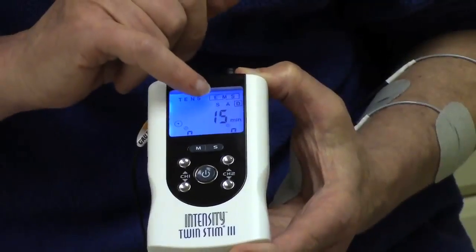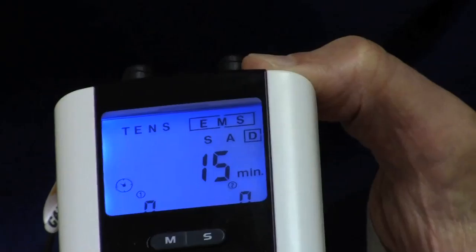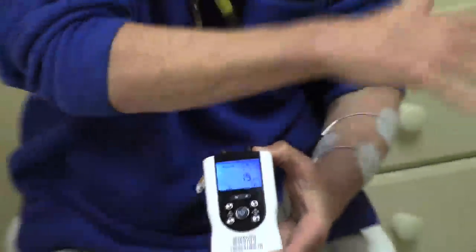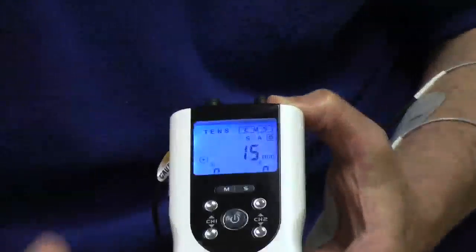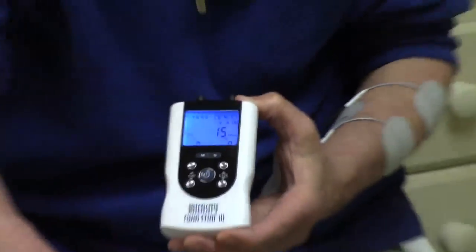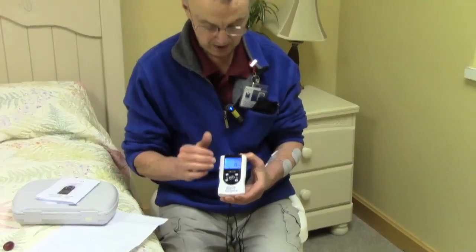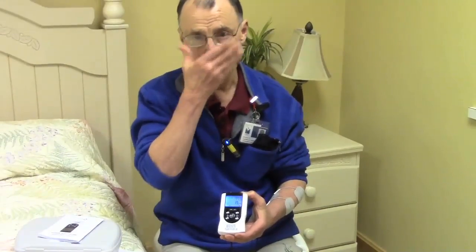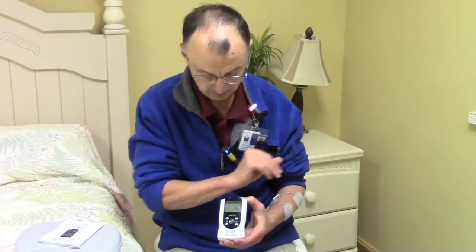There are three different modes: S, A, and D. If I wanted to stimulate my finger extensors and elbow extensors to get this motion, I would use S mode — synchronous. Or if I was just doing one muscle by itself, I would also do it in S mode. You'll see another video where I'm just doing that one muscle.